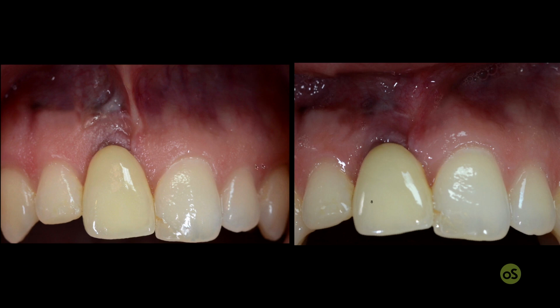The dentist who sent me the patient also tried to do something, as you can see during this time. It was a free gingival graft that was applied at the buccal aspect of this implant-supported crown in the attempt to mask the transparency, the color, but also to improve the coverage.